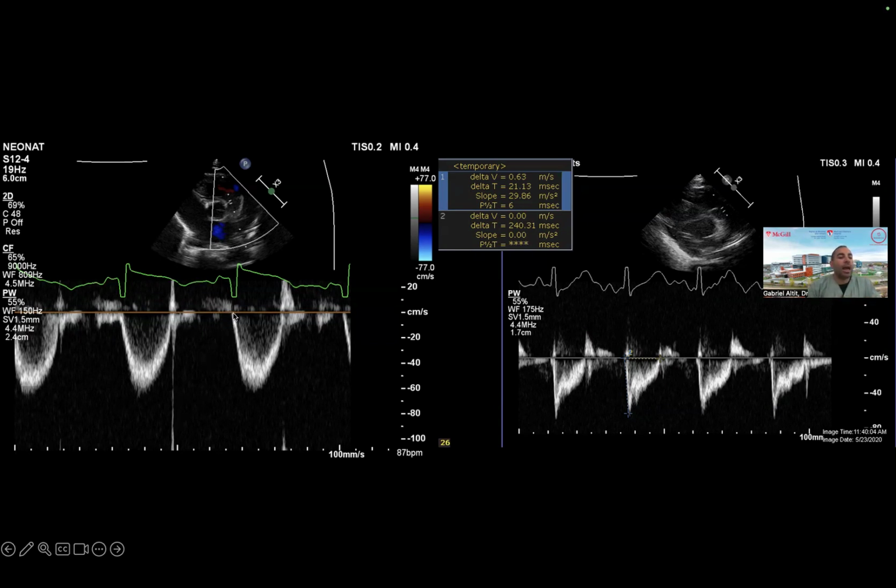Okay. And with diastolic or pre-systolic forward flow, often you'll see a little blip here. And that's often because you have high right atrial pressure. But you can go read on it on the website. It's a bit complicated. This is another example where you actually see a bit of the mid-systolic notch. I don't know if you see it here. We can appreciate it a bit here as well. It looks like a W. That's why some people call it a W.